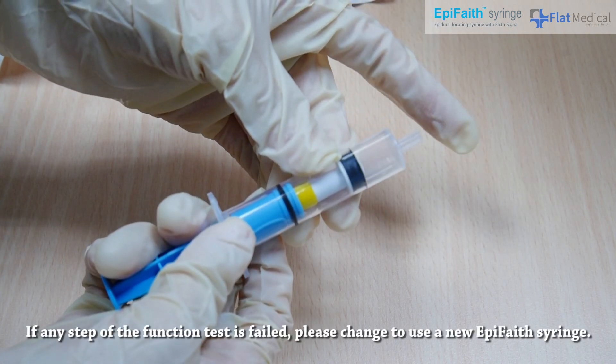If any step of the function test fails, please change to a new EpiFaith syringe.